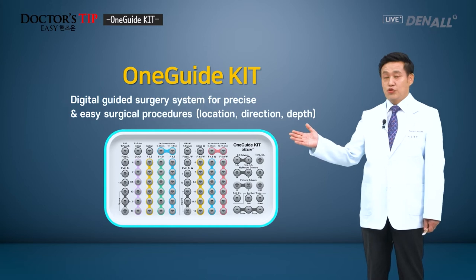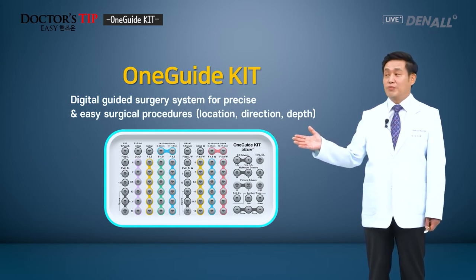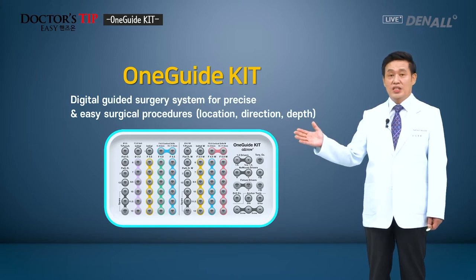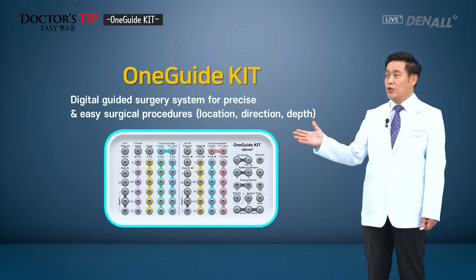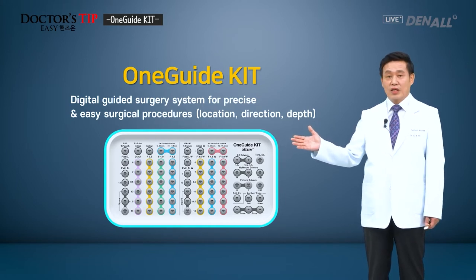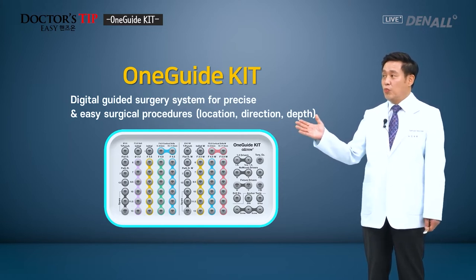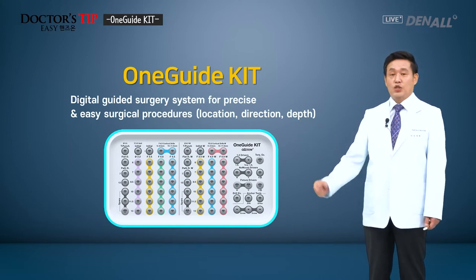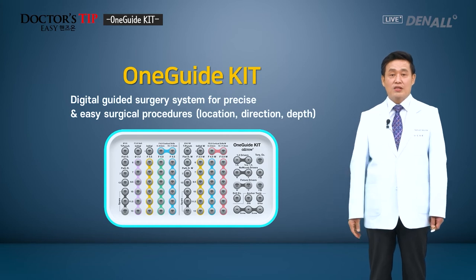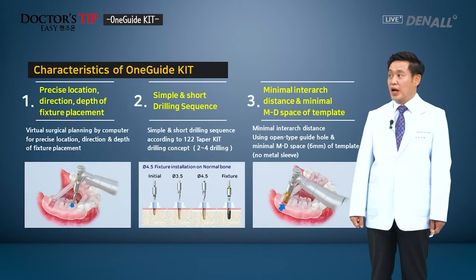As you all know, CBCT, oral scanner, and other digital devices have emerged, and now with digital technology, we can do virtual surgery and find the position of the final prosthesis, and accordingly make a guide and place the implant. With a digital guided surgery system, the fixture's position, direction, and depth can be accurately predicted, and surgery can be performed accordingly. That is the digital guided system.